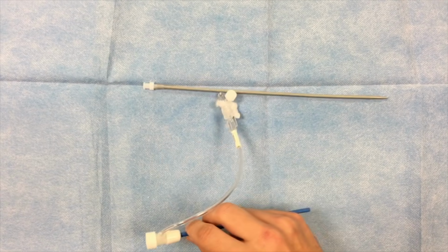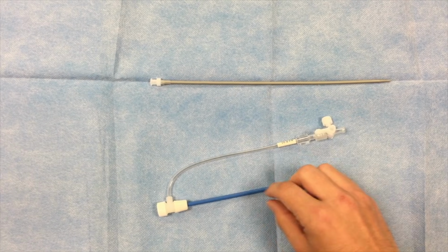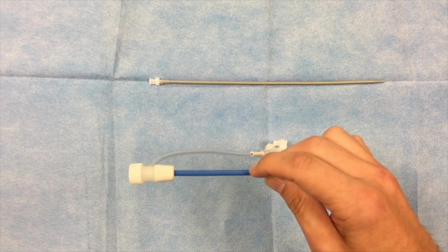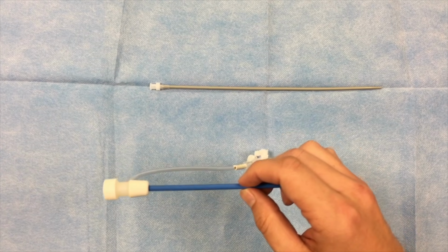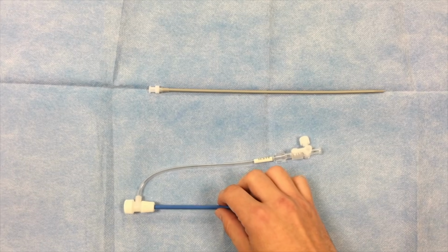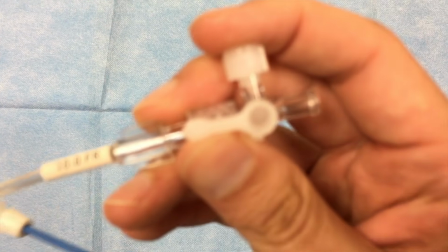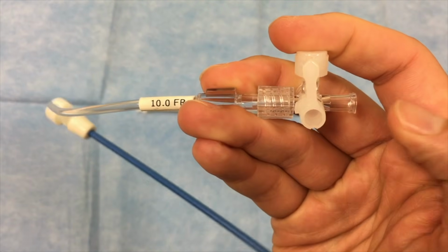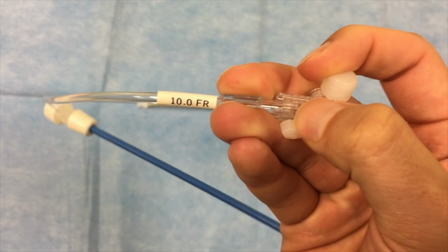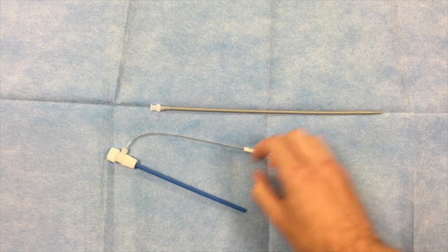This is done because if you imagine a smaller catheter through this sheath, there will be a space between the smaller catheter and the larger sheath. And in this space, the dripped saline will flow so that thrombus does not form. Whenever you hook something up to this tubing, make sure you turn the off switch superiorly so that the injected material can actually flow.